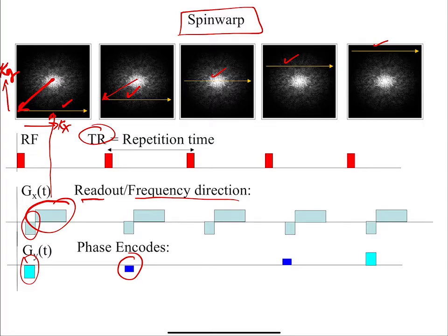Question? Will that initial readout pulse take it to half of the window width? Yeah, that's a great question. Ideally, it's going to take it out to minus WKX over 2, minus WKY over 2. That'll be the starting point, right at the corner.